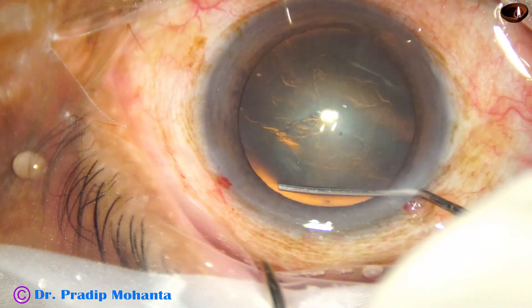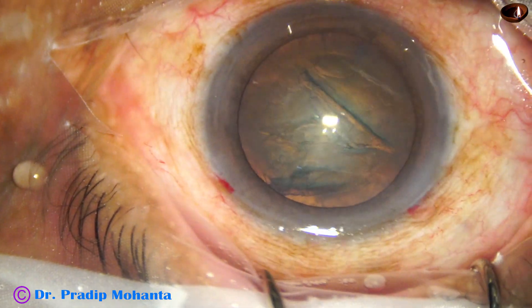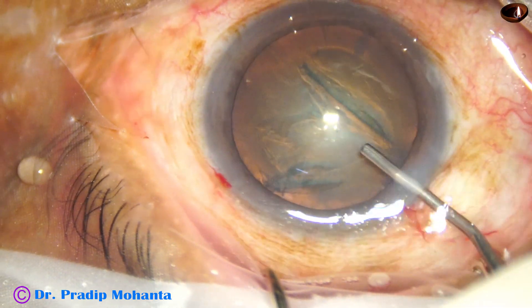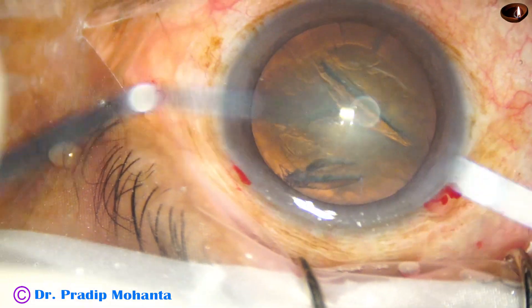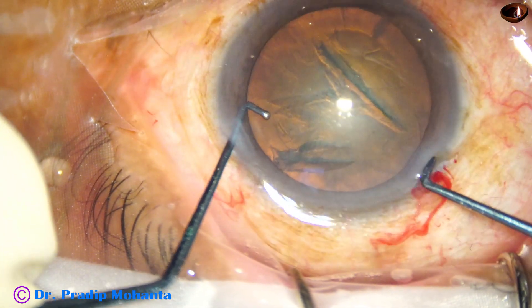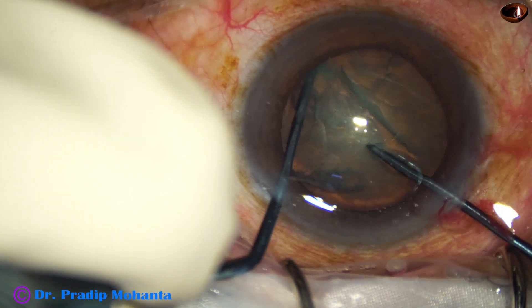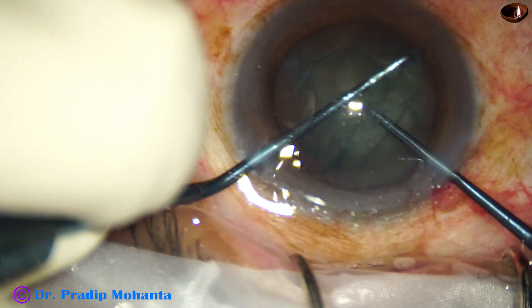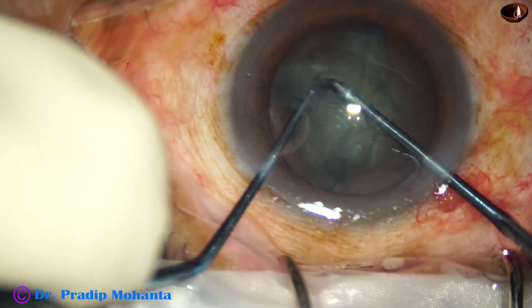Hydrodissection is done with the help of a 27 gauge cannula. Now it is time to pre-chop the nucleus. The pre-chopper designed by me goes through the main wound, and a nucleus sustainer goes through the side port. The nucleus sustainer hooks the opposite equator and supports the nucleus, dividing it into two hemi-nuclei.